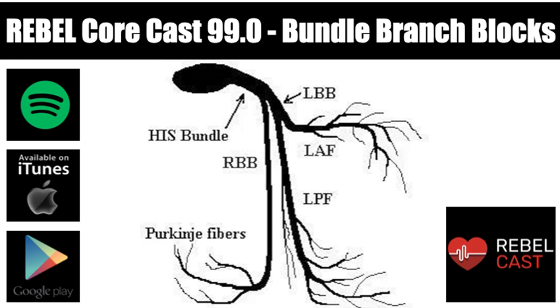The left anterior fascicular block, or LAFB, or left anterior hemiblock, results in LV depolarization via the left posterior fascicle only. This is going to produce small R waves in 2, 3, and AVF, and a tall R wave in the left-sided leads with a deep S wave in the inferior leads. The criteria for a left anterior fascicular block is a left axis deviation, so the QRS is up in 1, down in 2 and AVF, a slight prolongation of the QRS complex, but it's going to be less than 120 milliseconds, small Q waves and large R waves in leads 1 and AVL, and small R waves and large S waves in leads 2, 3, and AVF.